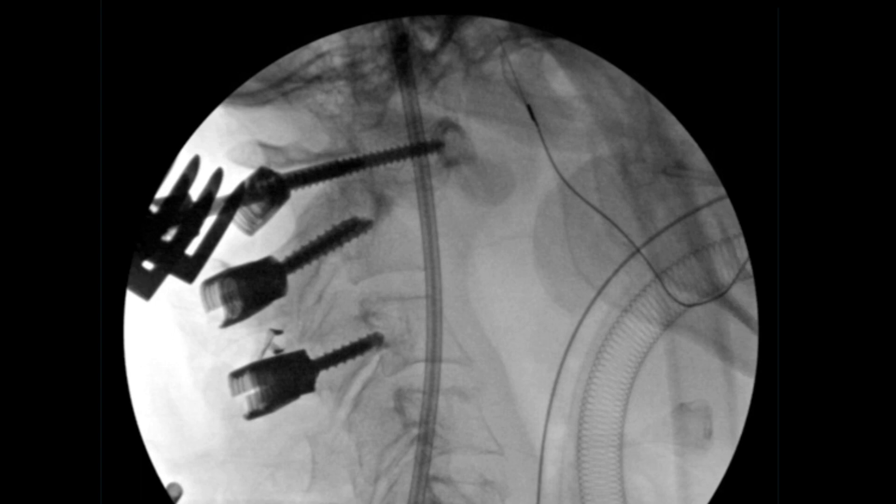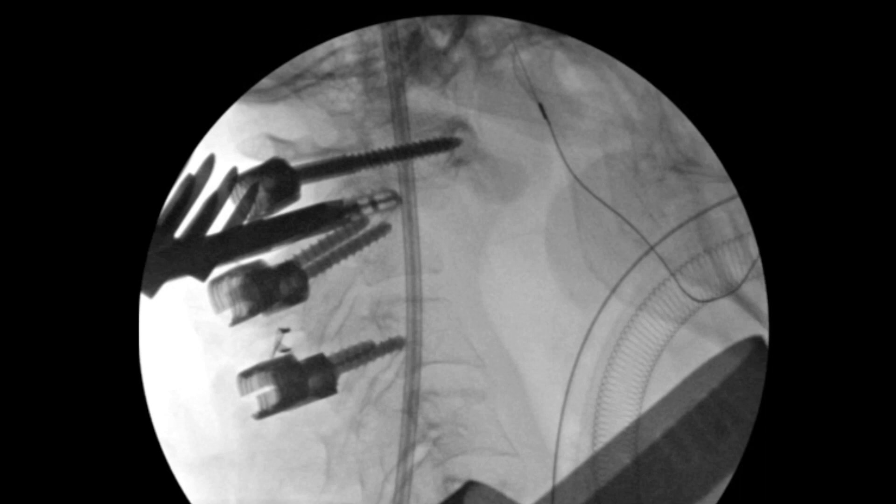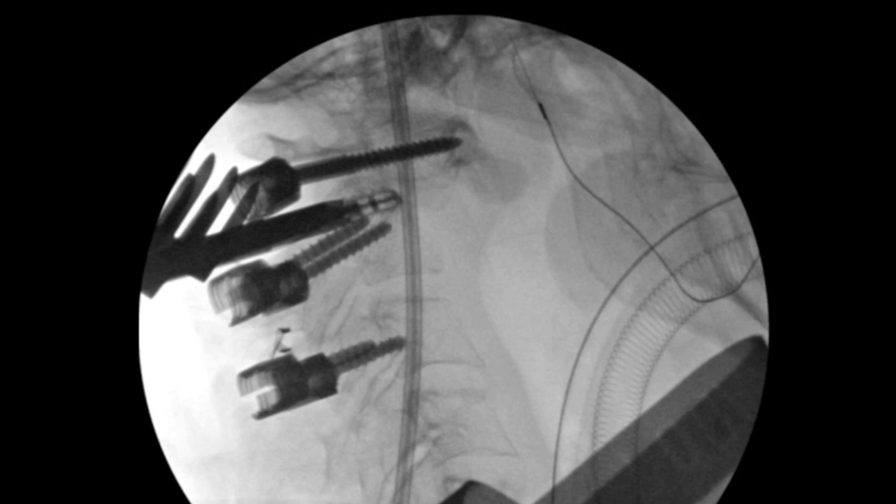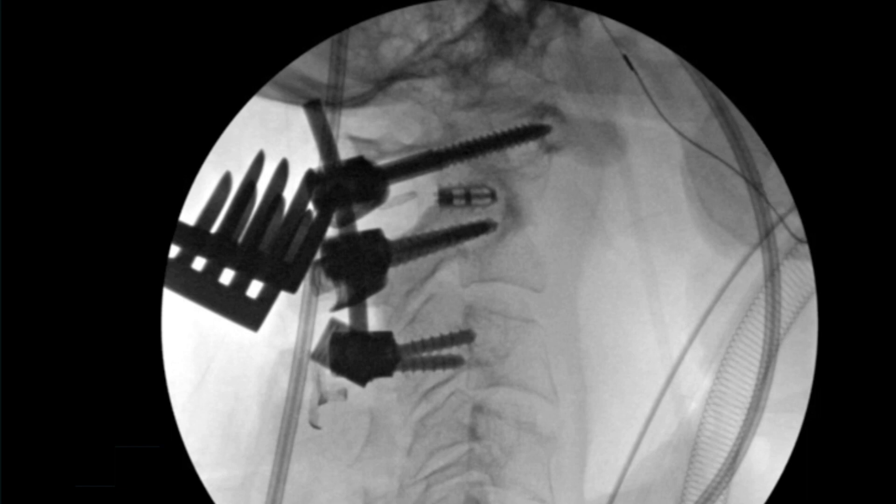Titanium interfacet spacers with bone allograft were inserted at C1-C2, inducing distraction of the joints and some joint reduction. An assistant proceeded to untether the Mayfield clamp from the bed, and neutral alignment of the head over the cervical spine was achieved by head extension. This configuration was locked into place with rods, which further contributed to joint reduction.